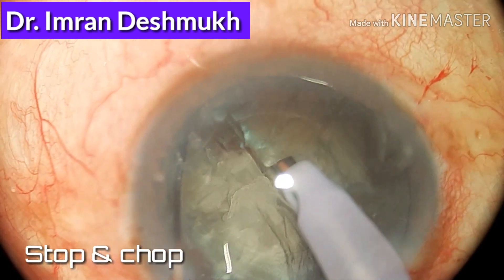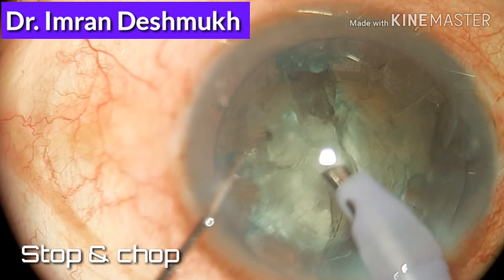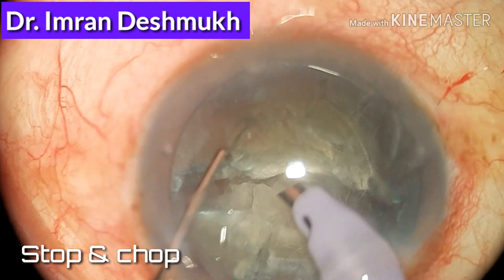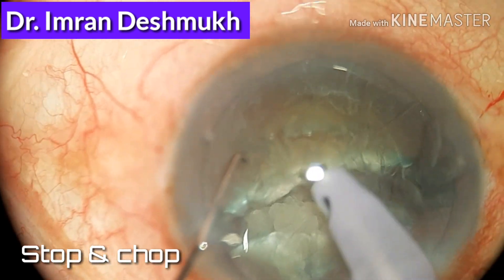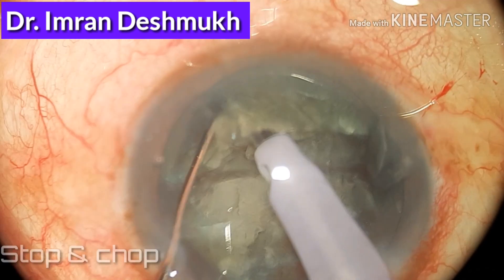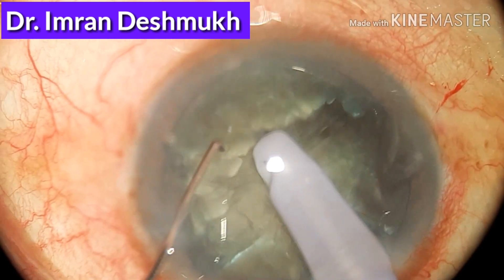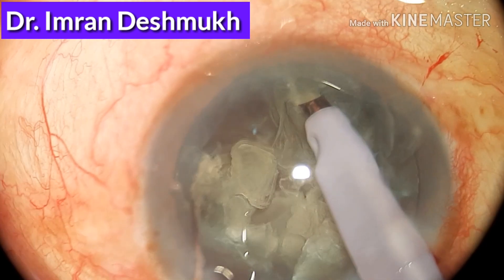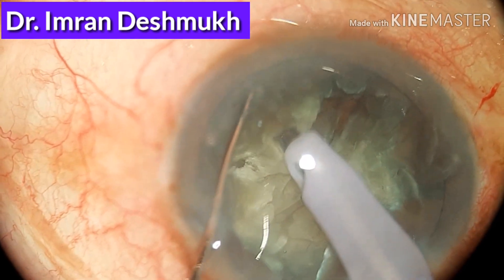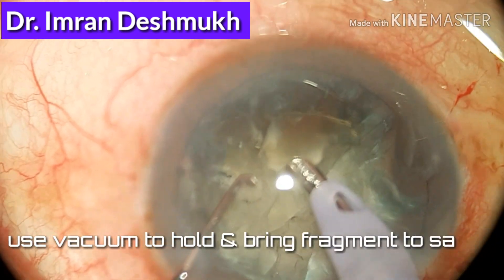Hello friends, today we'll be discussing how to remove nuclear fragments during phacoemulsification cataract surgery. Last time we discussed how to do stop and chop and how to divide and conquer the nucleus. As you're seeing right now, this is how we're doing stop and chop. In this video we'll discuss how to remove nuclear fragments after making all the nuclear pieces.